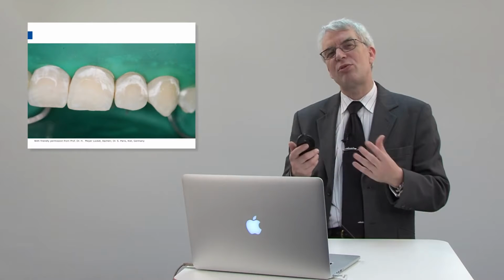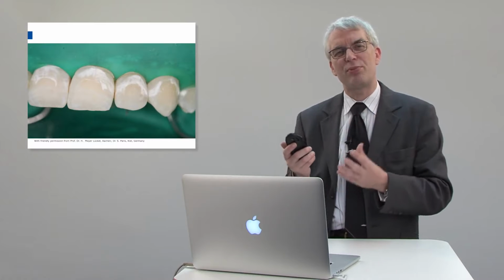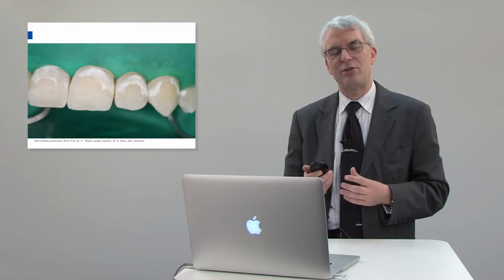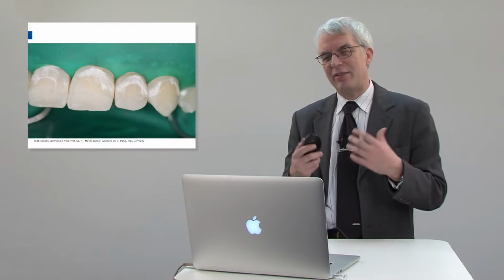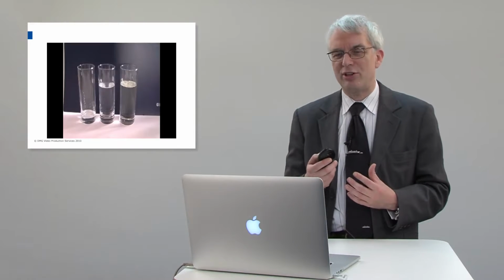But say you don't see it. A portion of the tooth does not absorb the ethanol and does not vanish. Then re-etch that part of the tooth. All in all, you can go through 3 etching cycles. And then, if everything looks nice, you commence and do the infiltration.